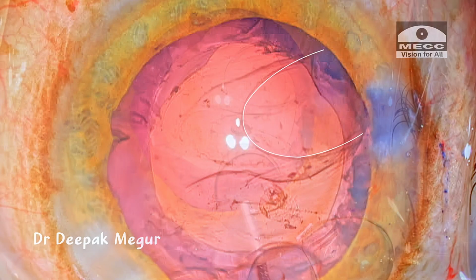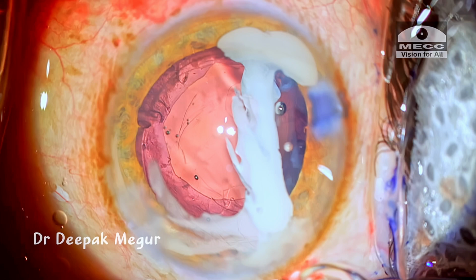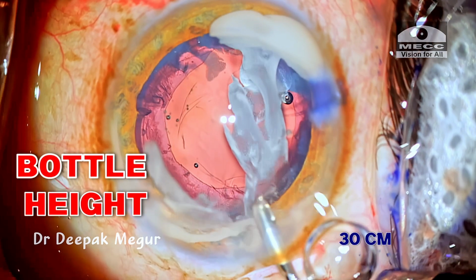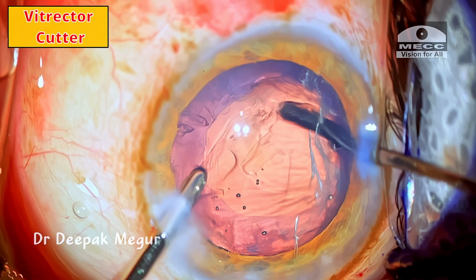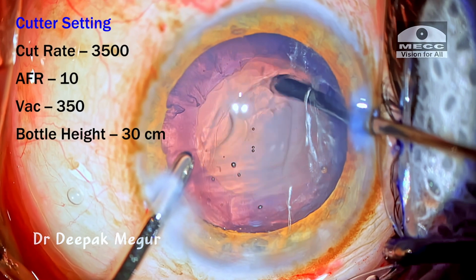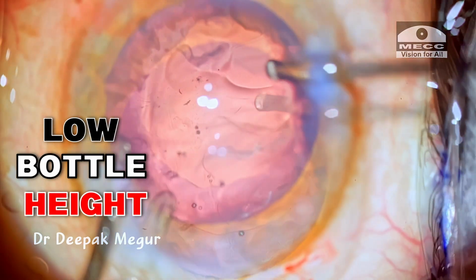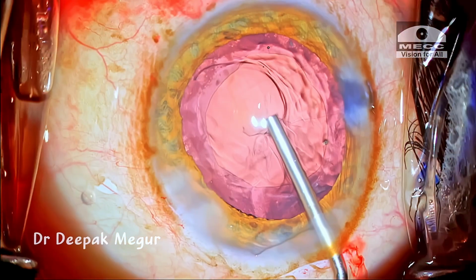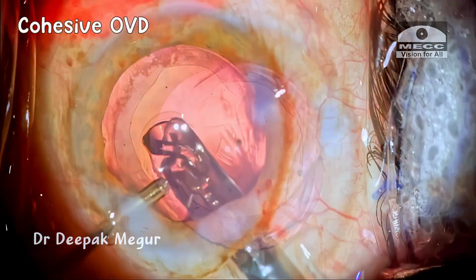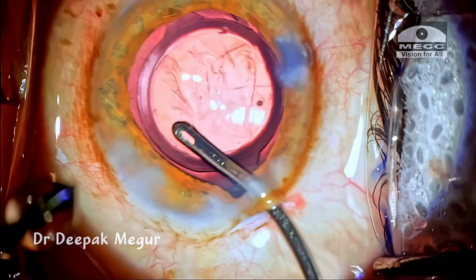Another case with posterior capsular tear, but this time with vitreous disturbance. Before beginning anterior vitrectomy, the bottle height is brought down to 30 centimeters. The vitrector is held below the level of the posterior capsular tear. The prolapsed vitreous is taken care of. The flow rate of the vacuum is kept low to compensate for the low bottle height so that the chamber equilibrium is maintained throughout. During anterior vitrectomy, during cortex aspiration, and even after putting the lens into the bag, the posterior capsular tear size remains the same.